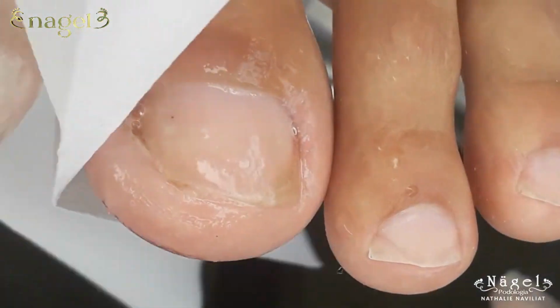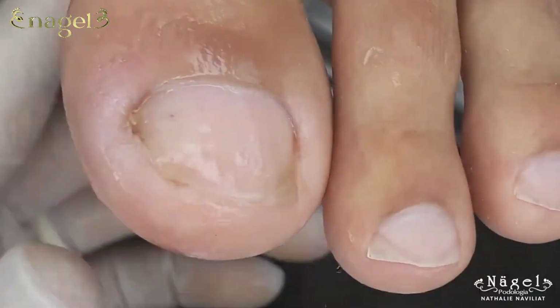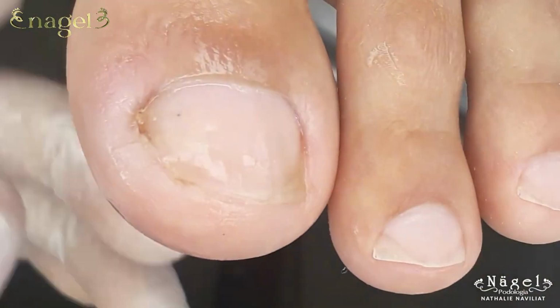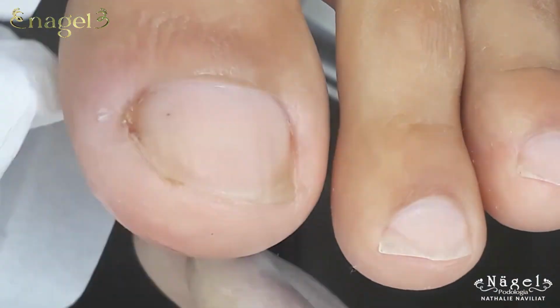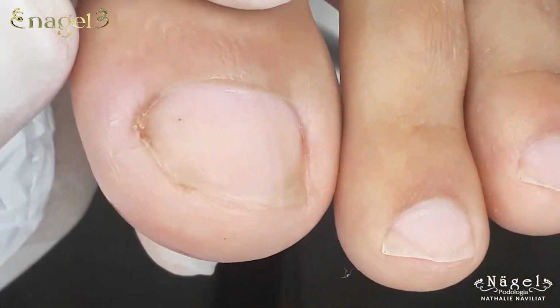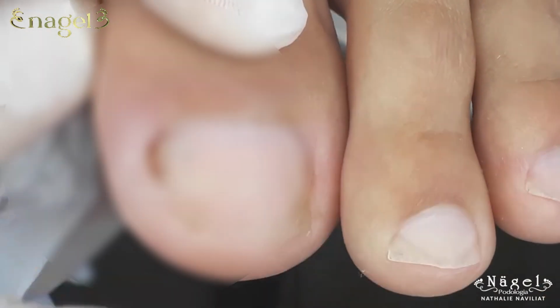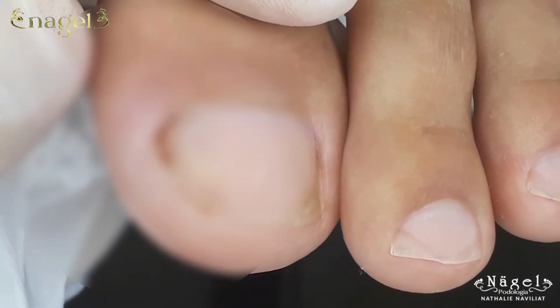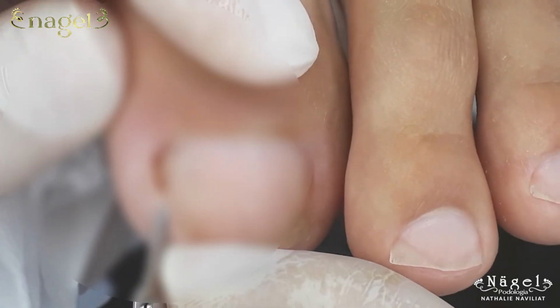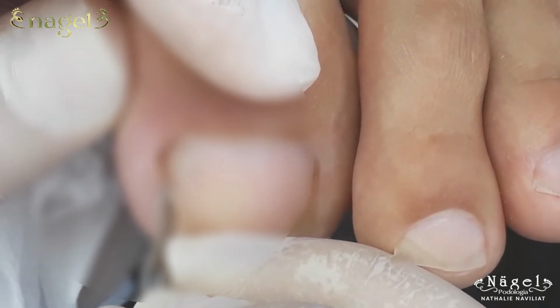He says there's a piece in there, and I confirmed that the spur isn't fully at the edge, but is definitely causing trouble. I start by cleaning the area with antiseptic, just like I did on the right foot, to ensure sterility. I pick up my precision tweezers and carefully examine the outer edge of the big toe. The nail here is also slightly rounded, like the right foot, so I take extra care not to disturb the surrounding skin. As I work, I explain.